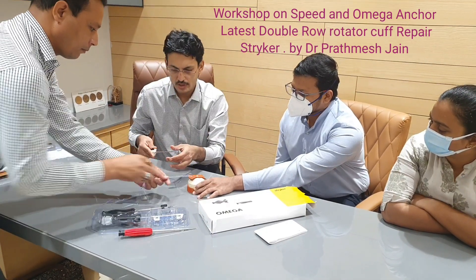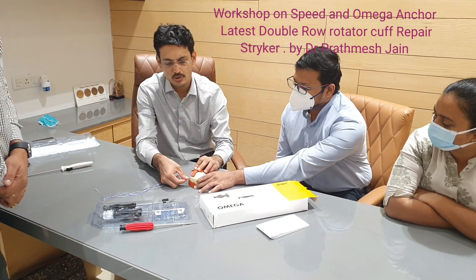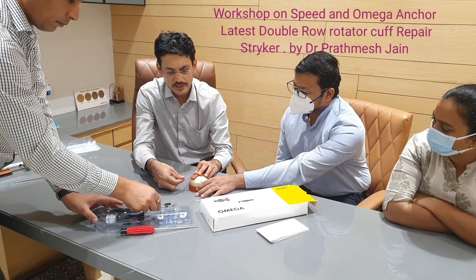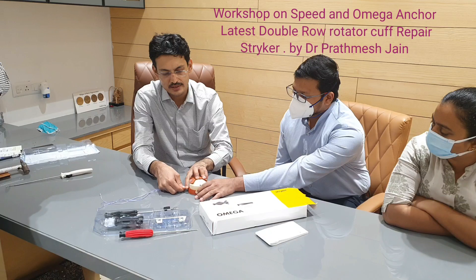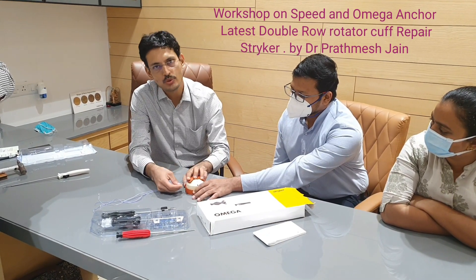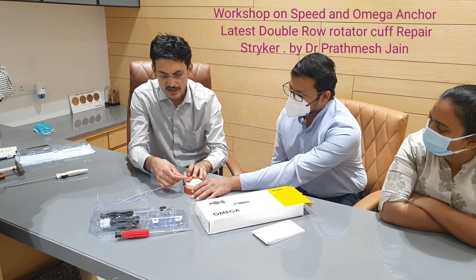Now you are done with all four tapes and you want to use these tapes on a lateral fixation device. There are two techniques: you can just leave them and tie them as is, or you can tie these tapes with each other and then use them on the lateral row.